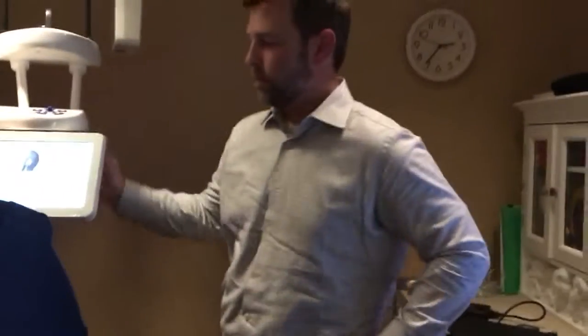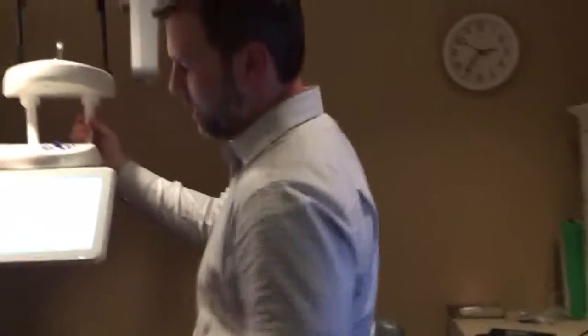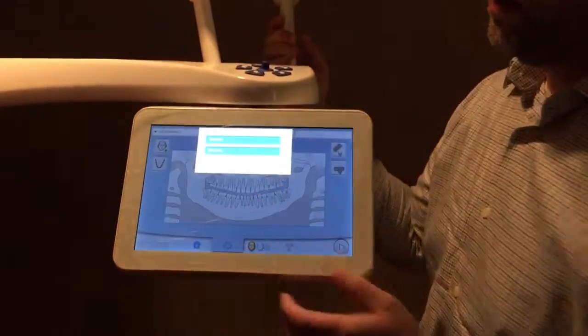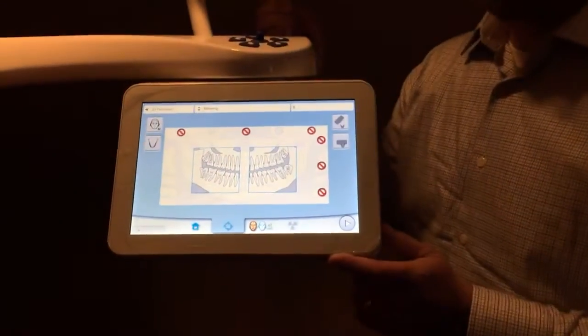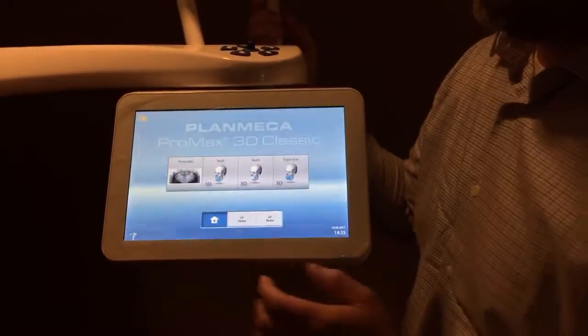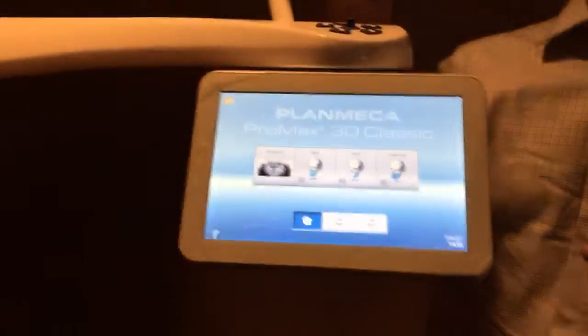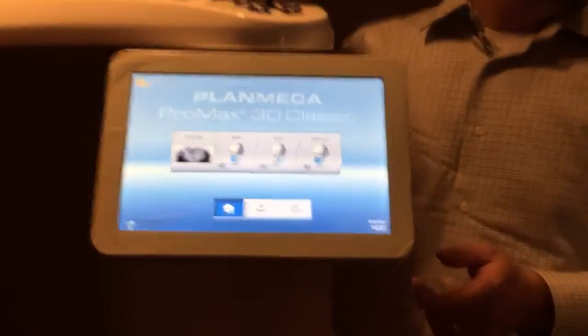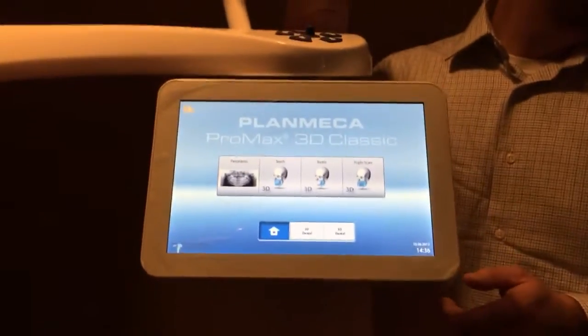For bite wings, we hit the pan button, then change it from standard to selecting bite wing. Let me walk you through that process again — it looks straightforward once you see it.